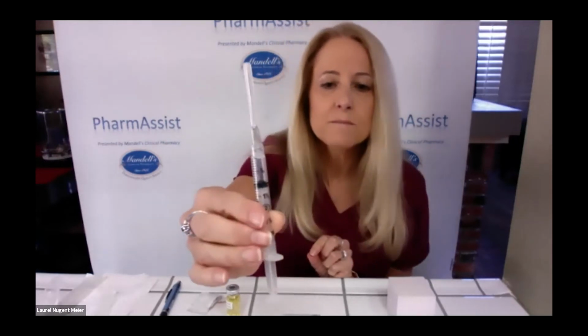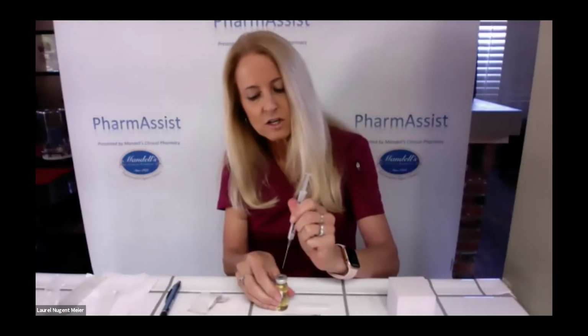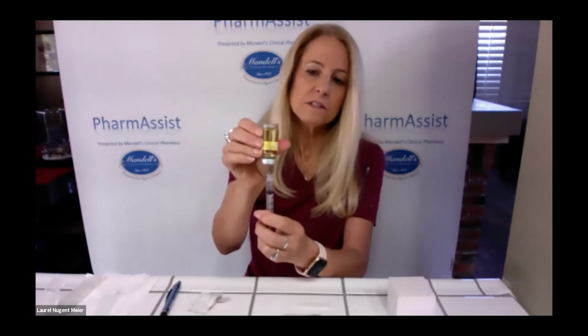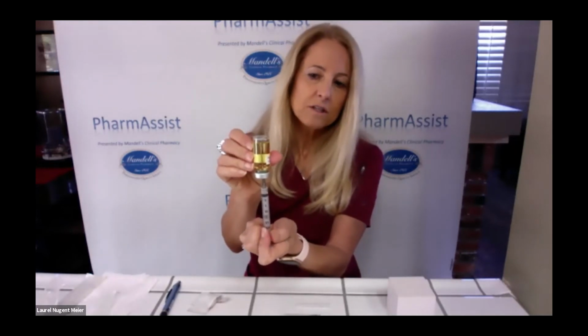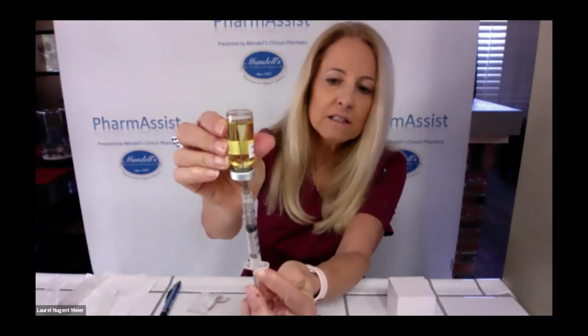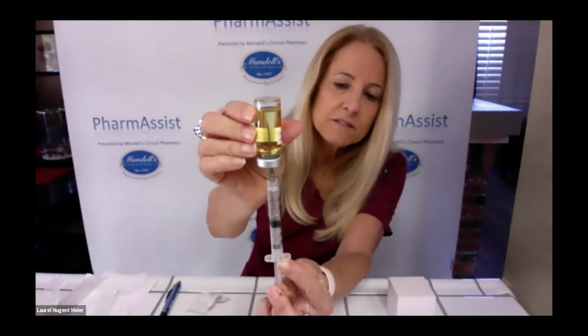And then you're going to draw up the amount of air equivalent to your dose. And I'm going to use 1 milliliter as an example. So take off your cap, inject the needle into the circle in the top, turn everything upside down, and then you want to make sure that you can see the tip of the needle in the oil. Push the air in and pull back and let that oil drip down the side. It can take a little while, so just be patient with it. You can see that it's dripping down the side.